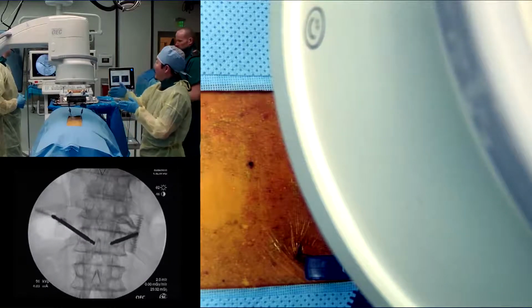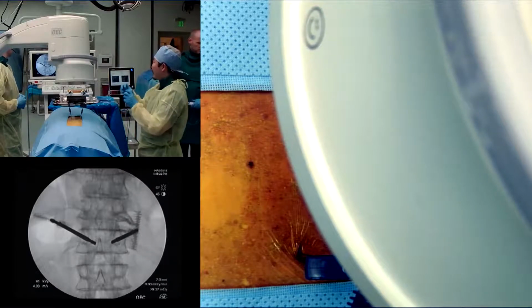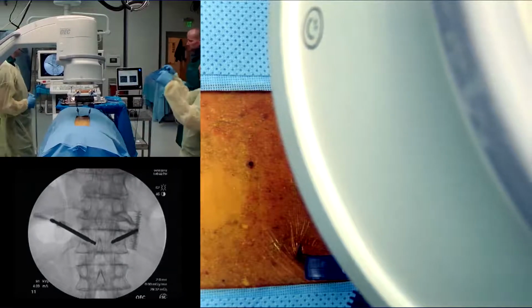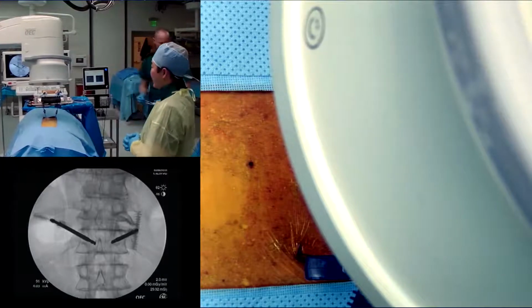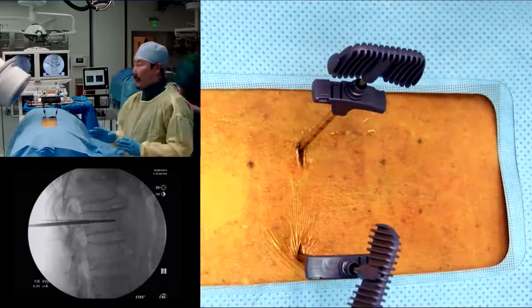So I am in my part of my zone. Zane is in his part of his zone. We're going to get a pretty good fill when we take a look at that. So go ahead and save that and transfer that over. We see that nice going from cranial to caudal on the thoracic view. So go back to lateral again. So there are a couple things here.